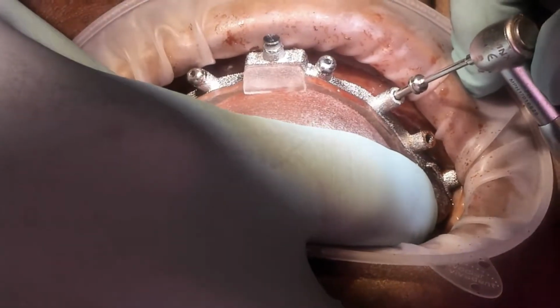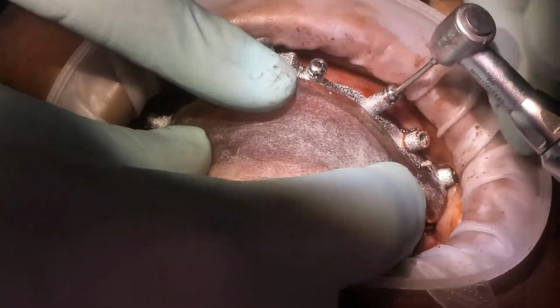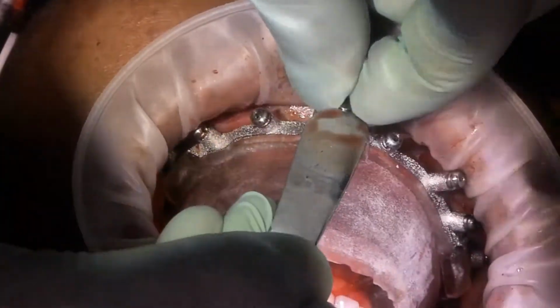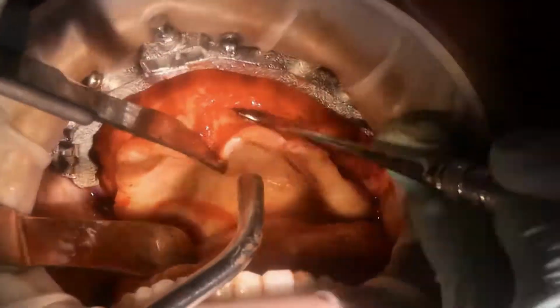We've heard issues over the years that if the sites are already drilled and then the fixation base and the pin guide are removed, it could be difficult to find the holes again when inserting the fixation base later in the day when performing the other arch. However, the amount of accuracy that you get when you have both pin guides in is probably worth searching for the holes.